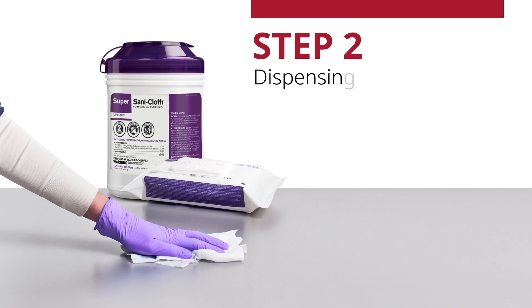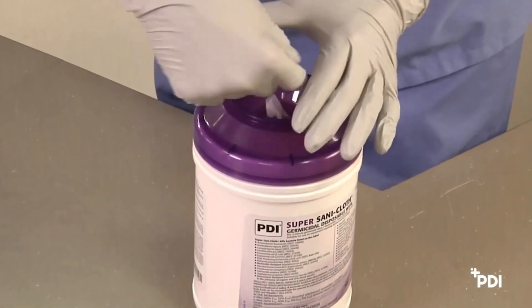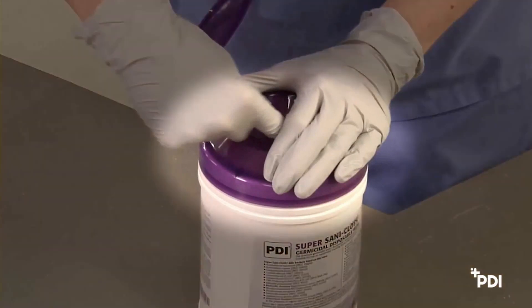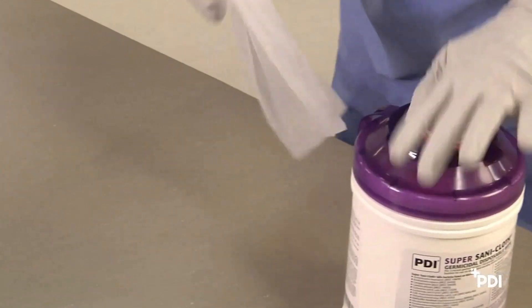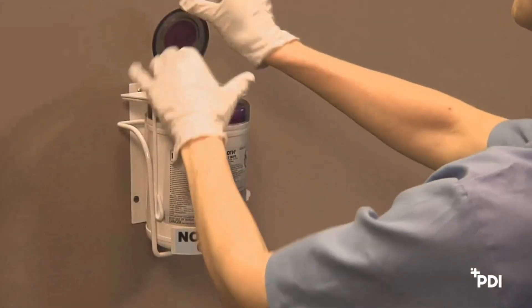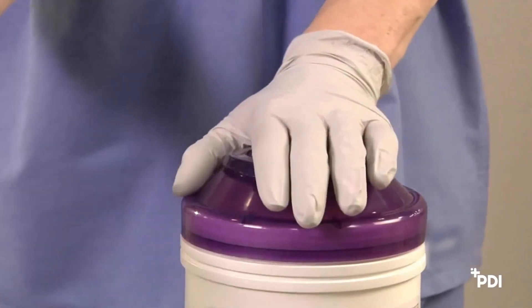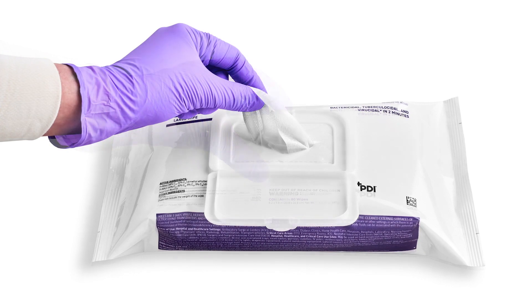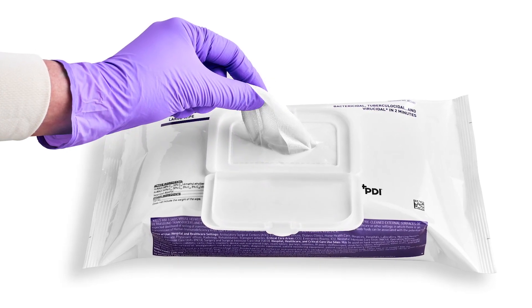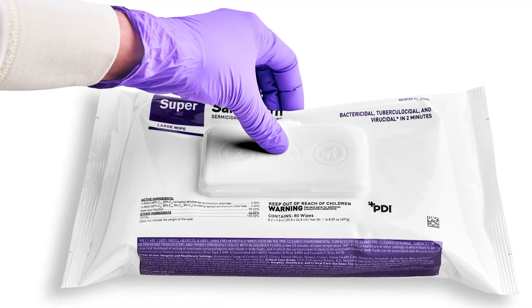Step 2: Dispensing a Wipe. When dispensing a wipe from the canister, open the lid and cup one hand, covering the opening halfway. With your other hand, remove a single wipe with a uniform pull, out and away from your face and eyes. Close the lid so it snaps shut to prevent moisture loss. When dispensing a wipe from a soft-pack, continue to pull out the wipe at an angle. Snap the soft-pack lid closed after use to retain moisture.